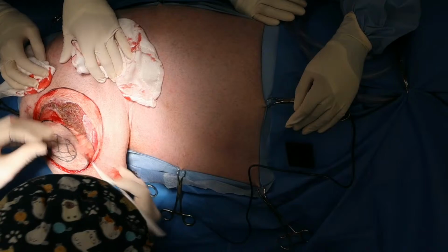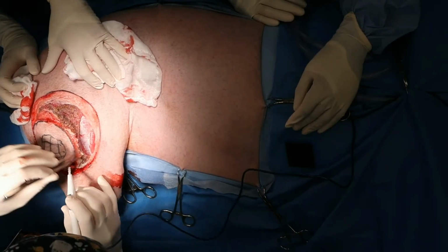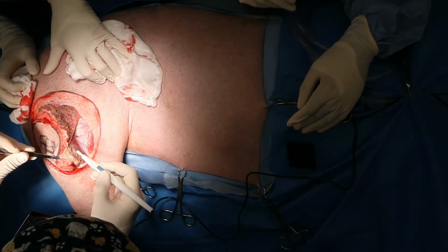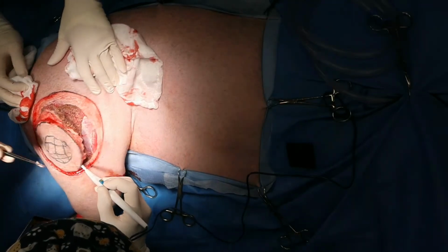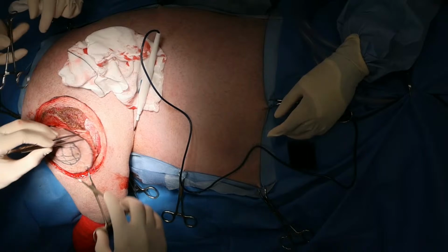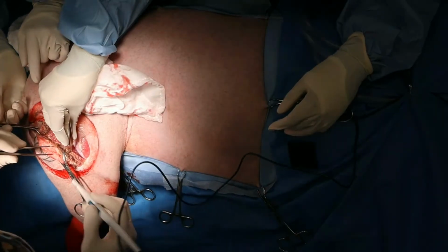So I'm trying to get partial thickness here, but it's so hard because it's so closely adhered. And whatever I do, I don't want to penetrate that fascial layer, because then my margin is compromised. Might get some towel clamps here. That's great, thank you.